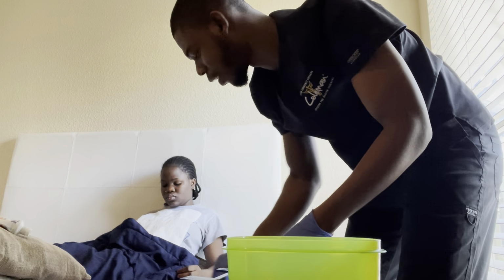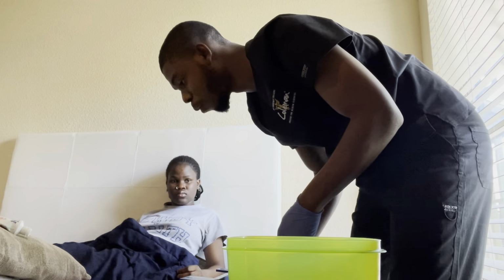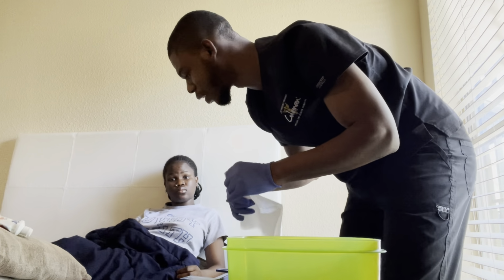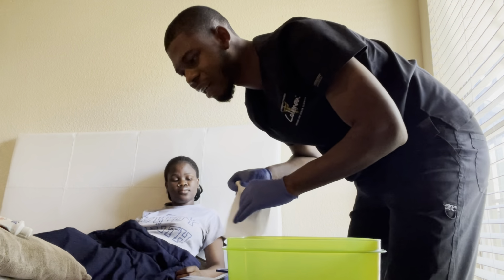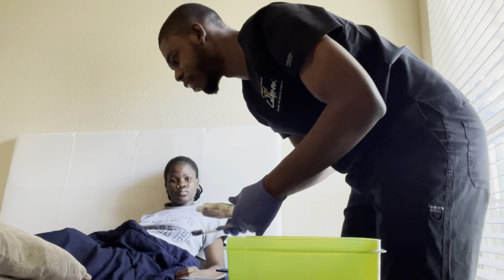Now that I'm done with that, I will take the patient drape and I will discard it in the emesis bin. When I'm done with that, I will give the patient a new drape or a towel to clean her mouth, and I will discard that in the bin too. When I'm done, I will perform oral hygiene for the patient.